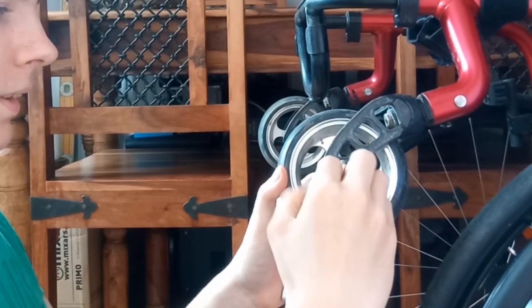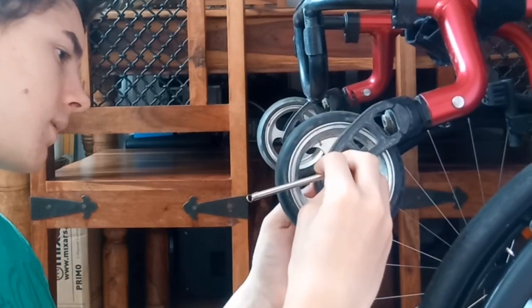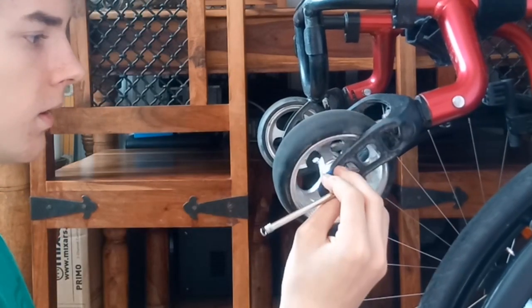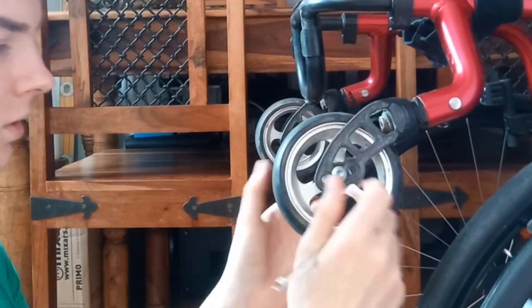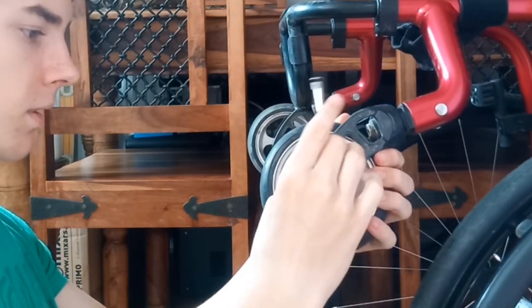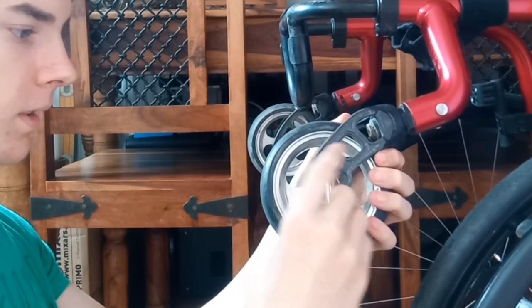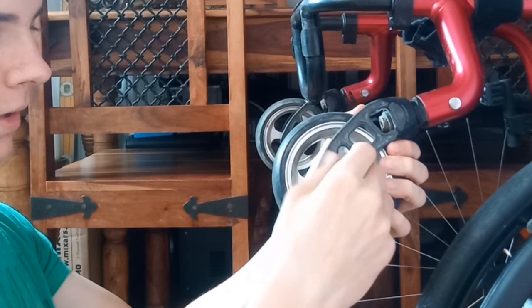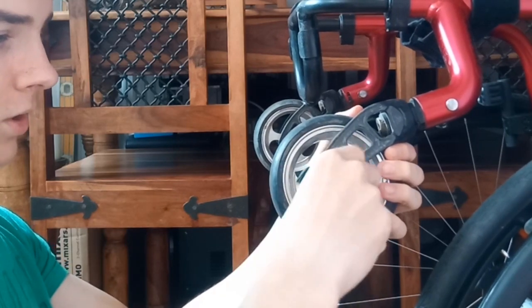Now obviously when you're removing this, the bolt just came off, so that's that. You can push. No, you can't. Just screw it all the way out. But now I don't need the spanner, so what I'm doing is just unscrewing this. In fact, I can just use my fingers now.